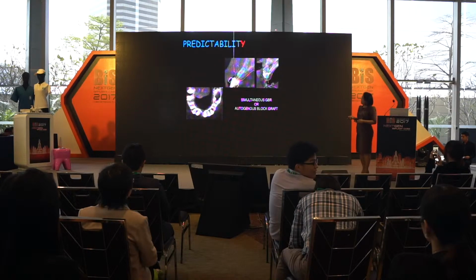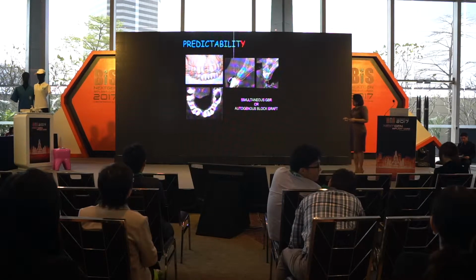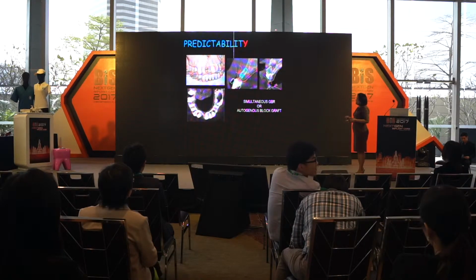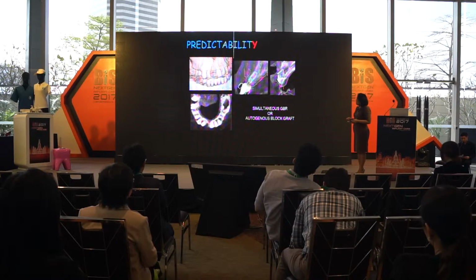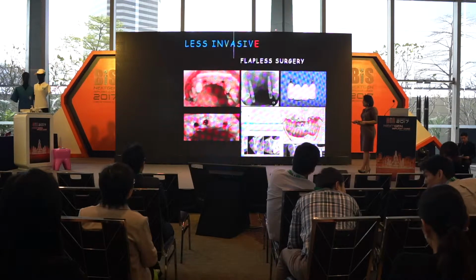Another one is predictability. You can tell your patient that you're going to do a simultaneous bone graft or an autologous bone graft, and you can discuss further surgery. And also you can give this data to the laboratory and discuss with them as well.